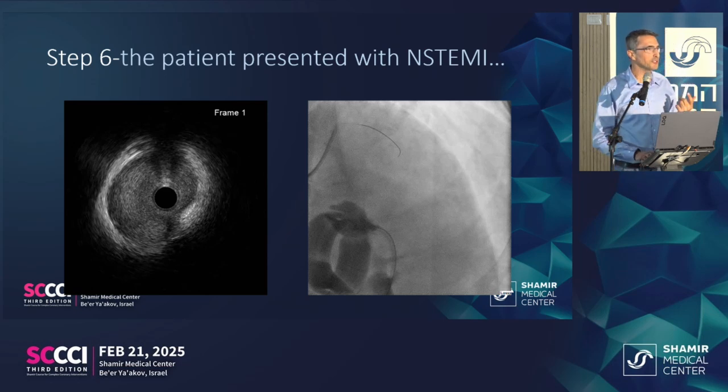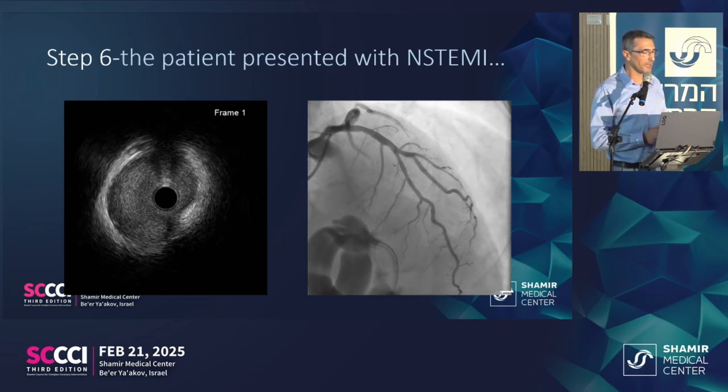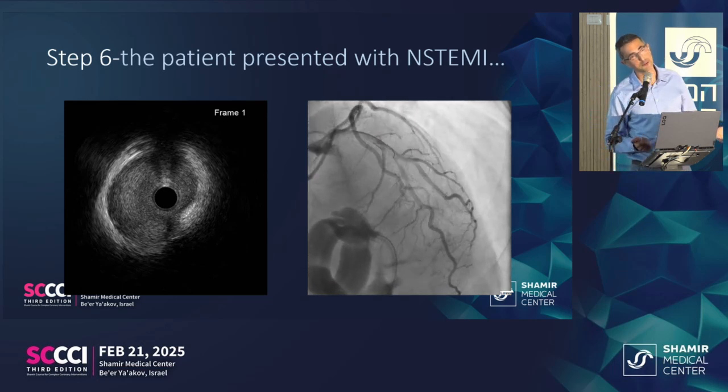Okay, but remember, this was an NSTEMI patient. So at the end of the day, we need to treat the patient, not the snare. So again, the colleague here said, listen, but still, this is an NSTEMI patient. We did something to the coronaries. Maybe we should see the coronary. I said, we don't worry about the coronaries, they're fine. I said, no, just take a picture. So we took a picture and then decided to do an IVUS because the IVUS was open.